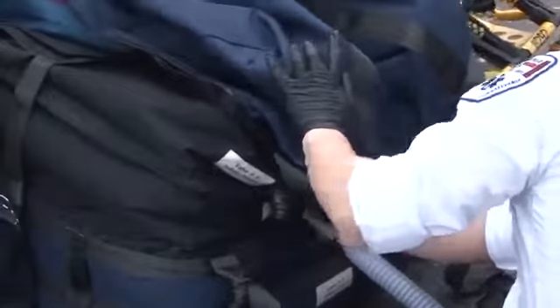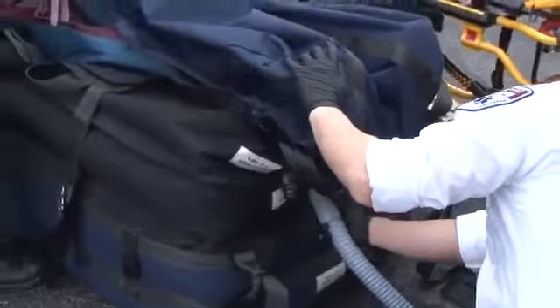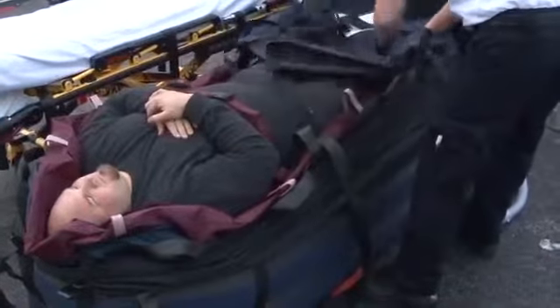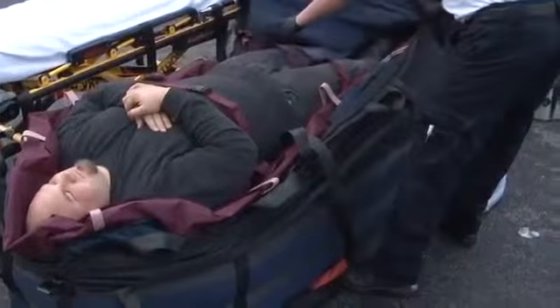Once next to the stretcher, inflate chambers number 3 and 4 sequentially, bringing the device up to the height of the stretcher. Unbuckle the patient's safety straps and body harness, and unzip the foot pouch. Ensure that the HoverMatt safety straps are buckled. Insert the air supply hose into the HoverMatt.